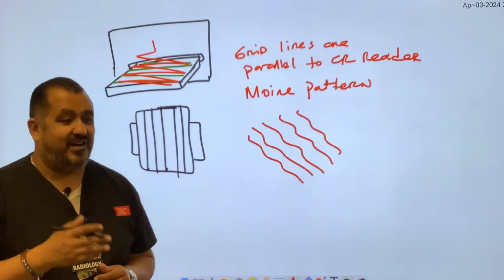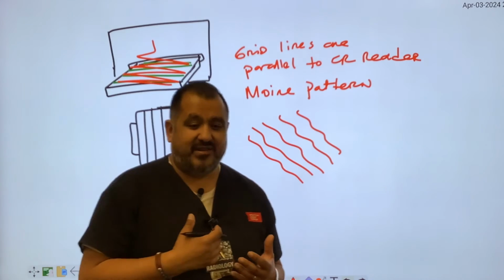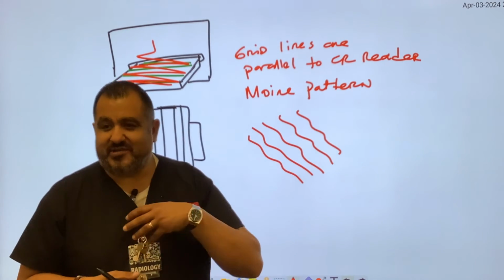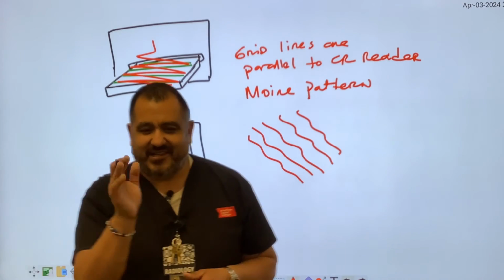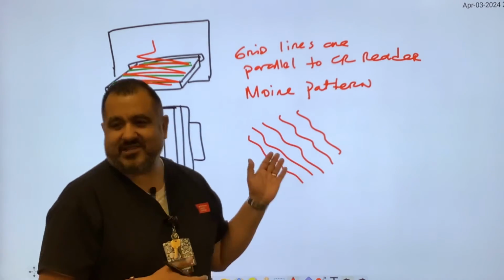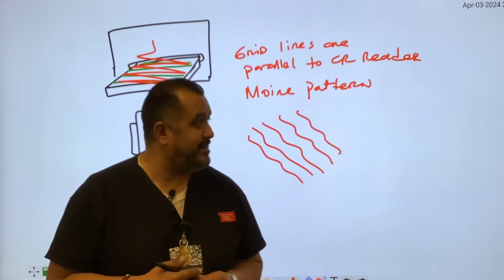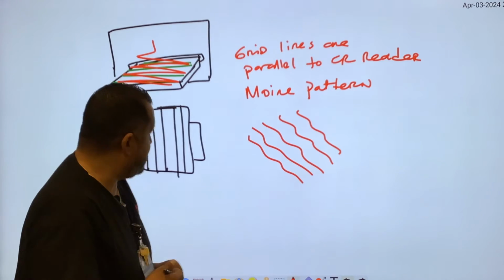Okay. I don't know if you guys ever seen at the fair or at the pier, you see these shirts and it says 1 tequila, 2 tequila, 3 tequila floor. You guys ever seen those shirts? And the letters start to get blurry, right? You get these diagonal wavy lines. That's the Moire pattern that they're using. All right. So those are your grid errors, and I'm hoping that this helps you.